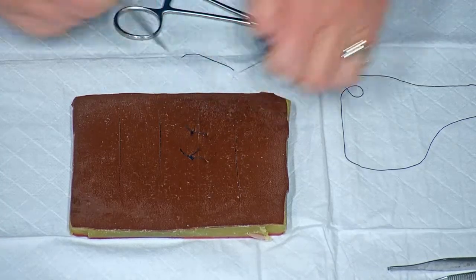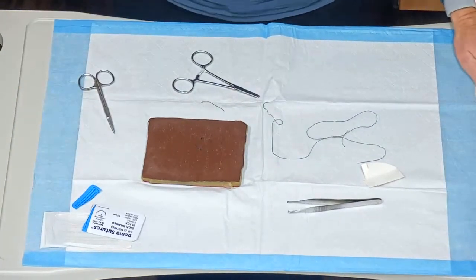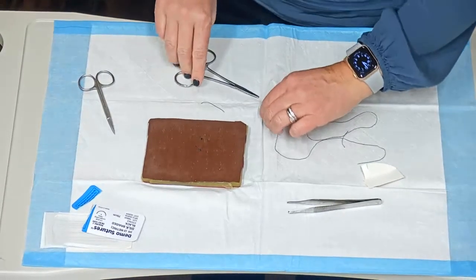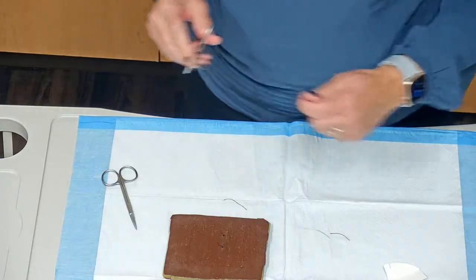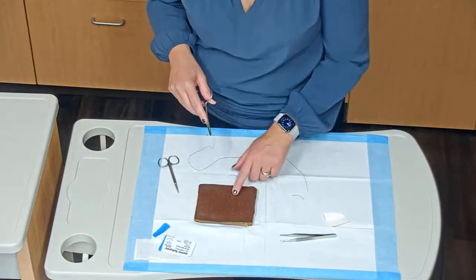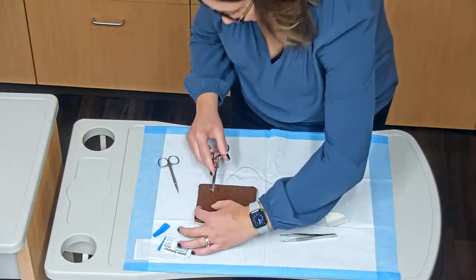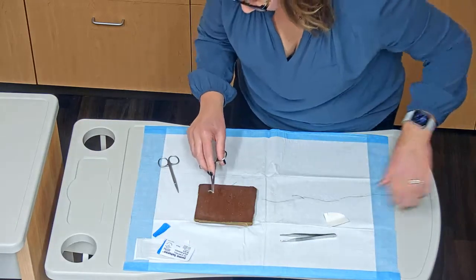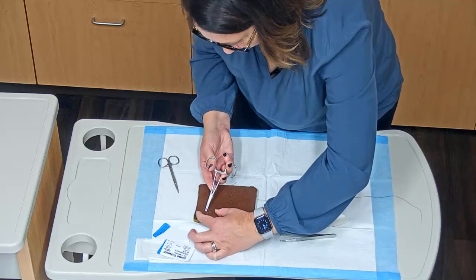The second, if there's midwifery students, a suture that you often use in repairing tears or episiotomies would be the running suture. So in order to do that, we are going to reload in the same way. What's nice about the running suture is that you can just do a continuous suture line without breaking and having all these separate interrupted sutures, which is great for that type of tear. So again, with this one, we're going to start at one end and go to the other. I won't go all the way down, but we'll get you started. So very similar start. We're going to go in about 5 millimeters lateral, come out.